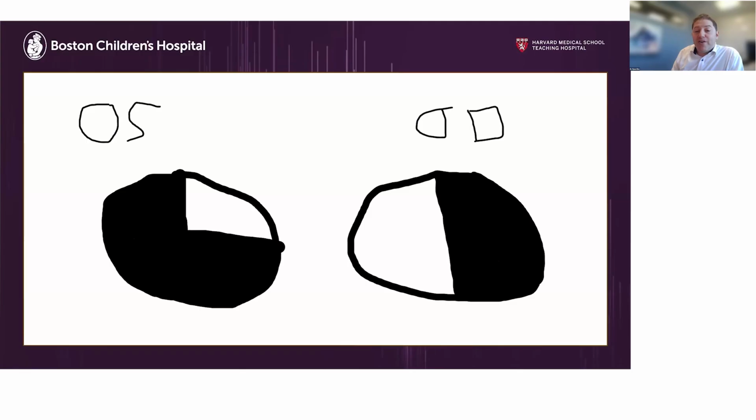A homonymous hemianopia is one from a lesion that we'll see in the next case where it's behind the chiasm and you see a left-sided defect or a right-sided defect in both eyes. So a homonymous hemianopia would be if the defect was actually here and here, versus the more bitemporal look here that you see.